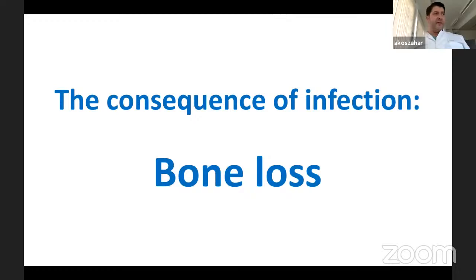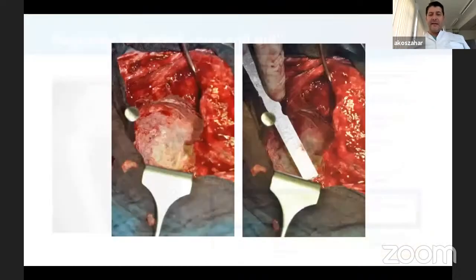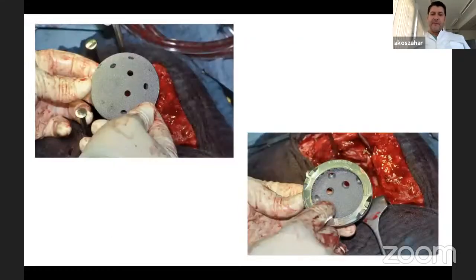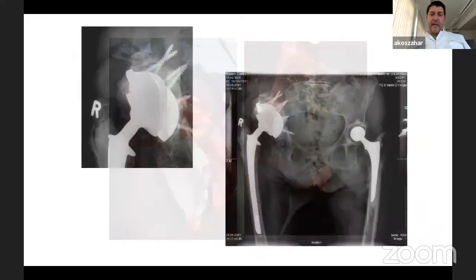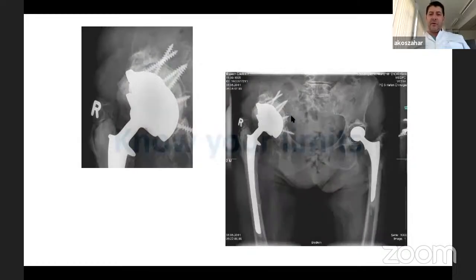Sometimes you have a bone loss with the infection, which is quite challenging, like in this case with the Paprosky 3A defect. And then you have to treat the infection and treat the bone loss in the meantime. Like in this case, 72 millimeters of defect. You need big jumbo cups, but trabecular metal is a good option because you can use this shell without cement. You can use screws to fill the defect. And then you can go for cementation inside the shell, use antibiotic loaded bone cement, and then you can combine with a cemented implant and you can also treat the bone loss.